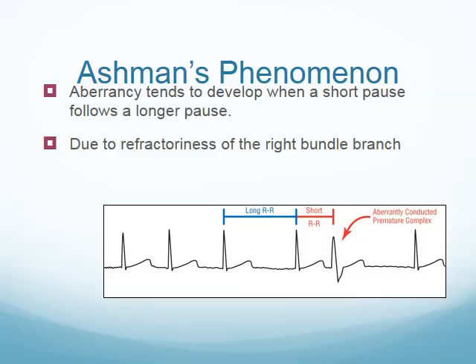You get to a point where the ventricles aren't able to repolarize before they receive the next impulse, and so it takes longer for that stimulus to stimulate both ventricles, so you get a wide appearance of the QRS, wider than 0.12 seconds, which is our maximum for a normal QRS complex.